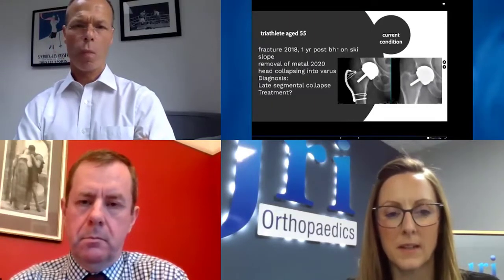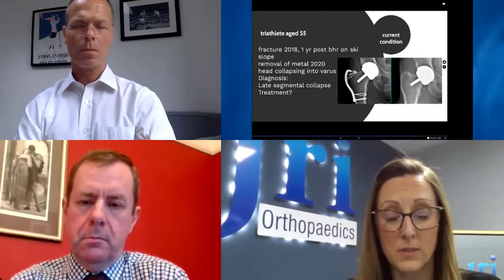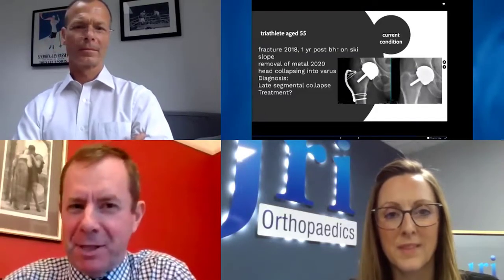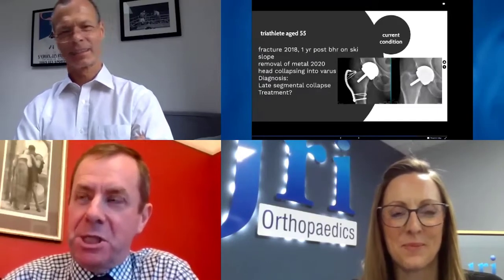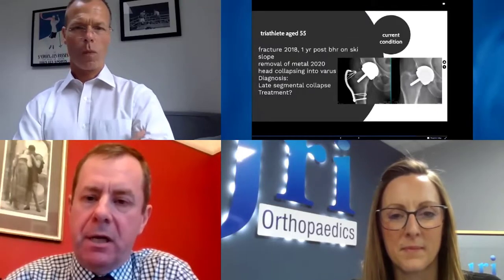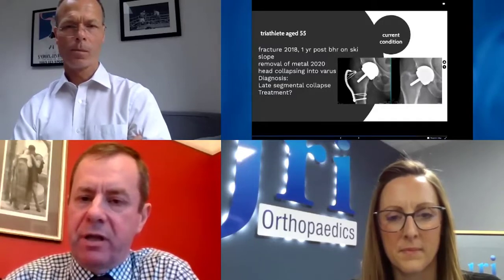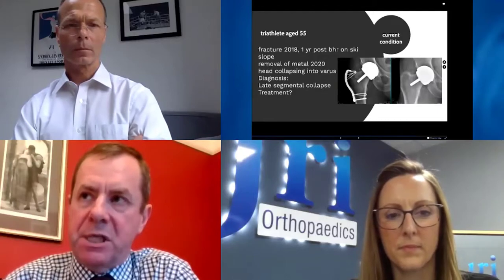So that was a size 16 there. Kerry, is the size 16 big enough? Not always, but there is a size 17. I think Justin just didn't have it that day. The size 17 has been just big enough in every case so far. There have been a couple of cases where to get it stable, I've had to recut the neck, sink the implant slightly lower and use a longer neck. And I've been able to do that without adversely affecting the offset two or three times. So I think the 17 is just big enough.